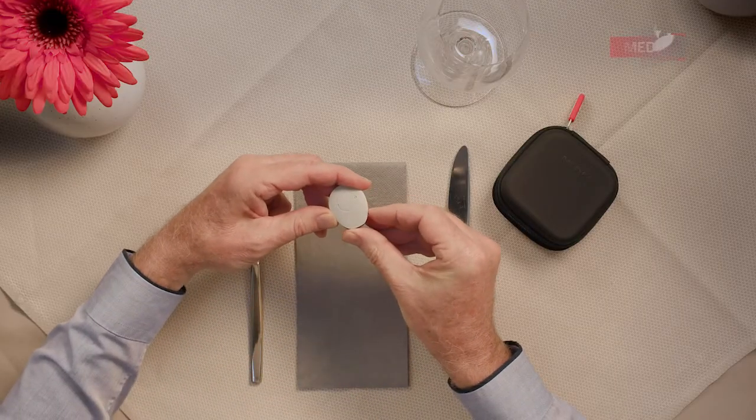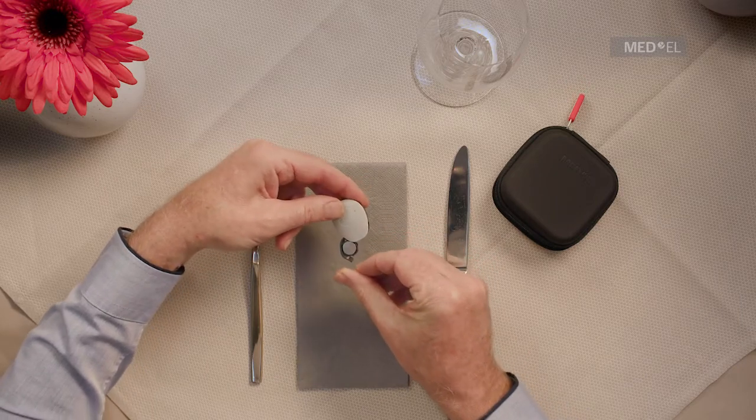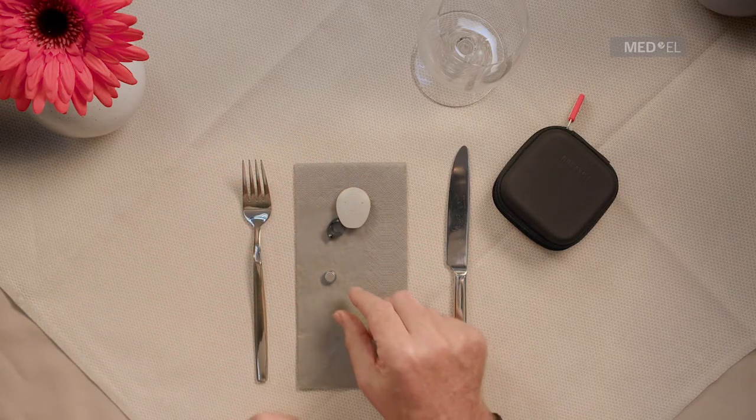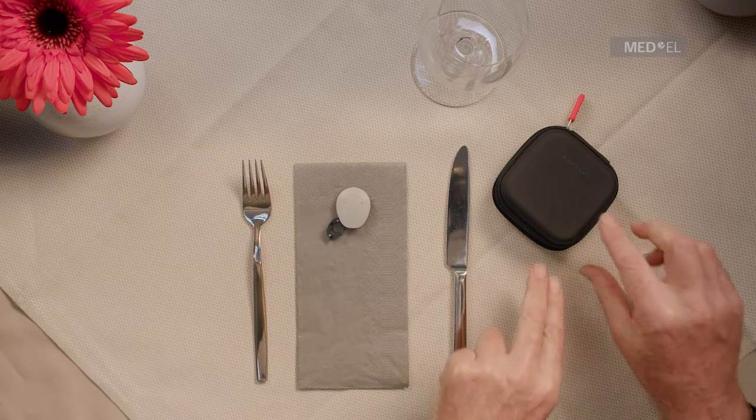To change the battery, pull on the raised lip to swing the battery compartment open sideways. Turn the audio processor upside down to let the old battery fall out.